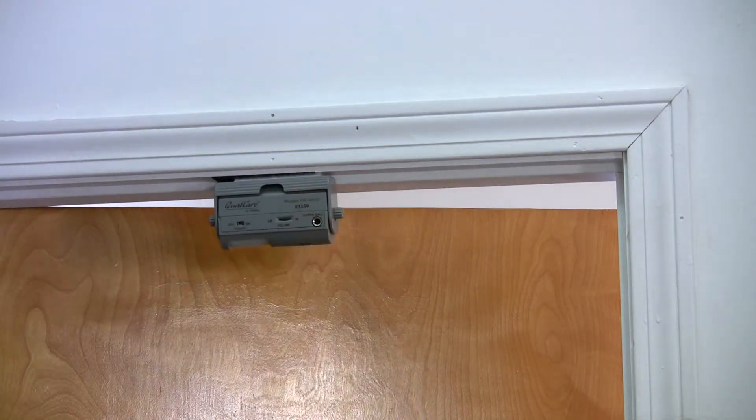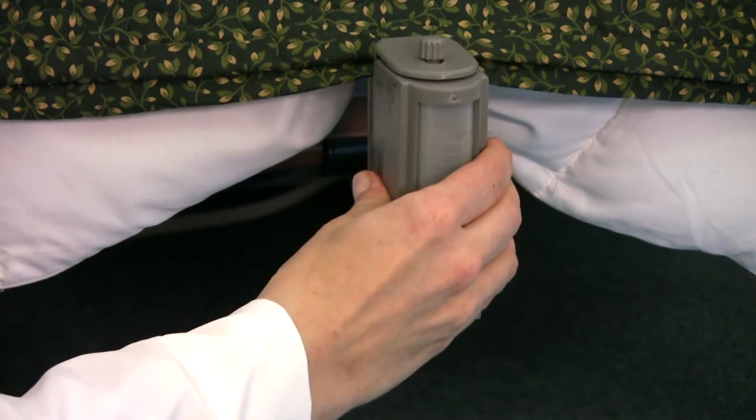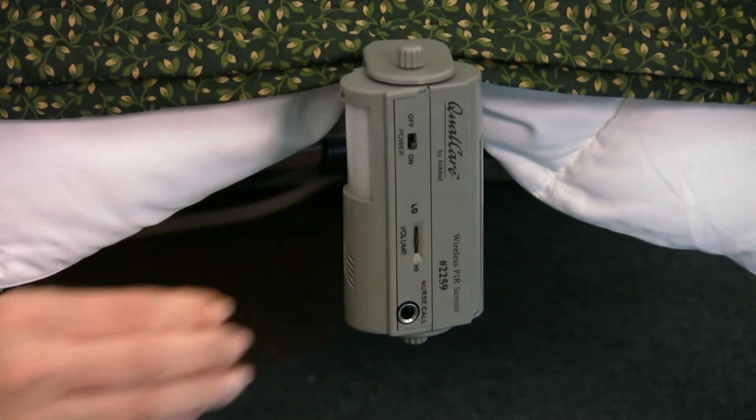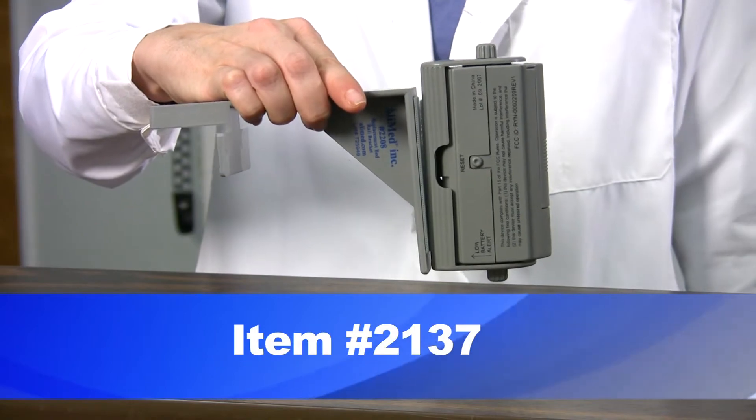To set up the alarm, select a proper mounting location based on the area to be monitored. You will want to position the sensor so that it creates a sensing field nearest where the patient is likely to move first when attempting to rise. Now securely mount the bracket to either wall or bed, making sure the unit is positioned so the reset switch faces away from the patient. This reduces patient tampering and allows easy access for the caregiver. A magnetic mount is also available with the purchase of the magnetic bed rail clamp PIR system. Once the sensor is securely positioned, test it to ensure proper function.